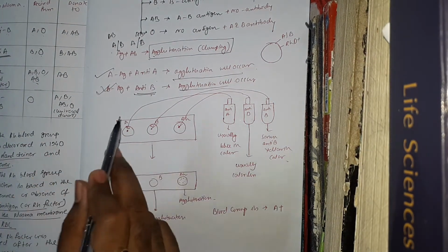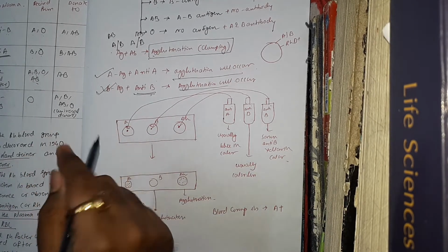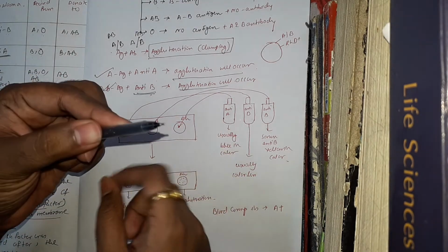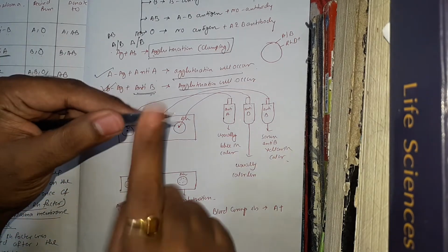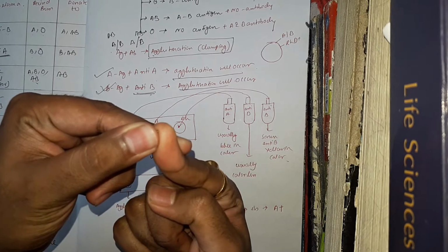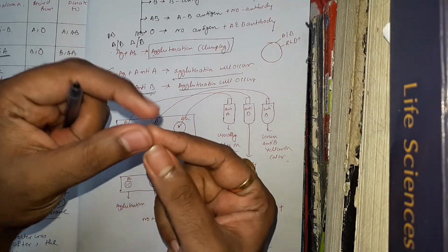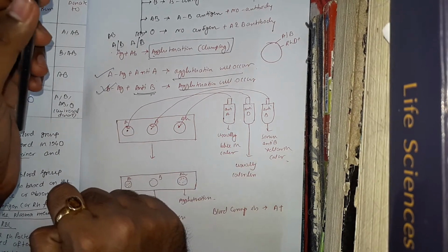And remember one thing, that we mark the area in opposite portion of the slide relative to where we perform our practical. After this, with the help of a needle, I will do a small prick in my fingertip and make a small hole, and with the help of this I will put 3 small drops of my blood, right?